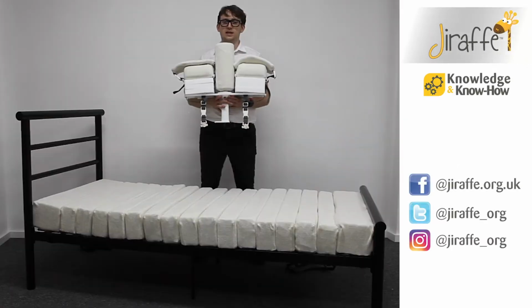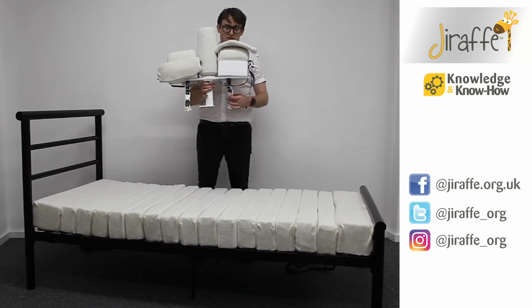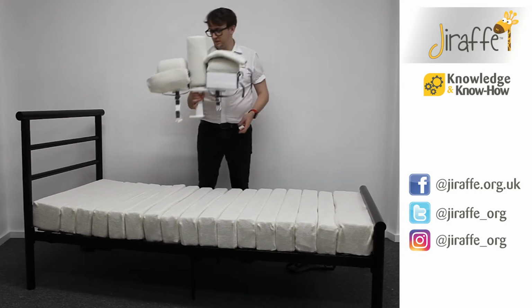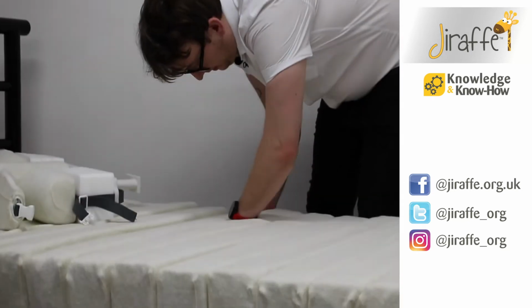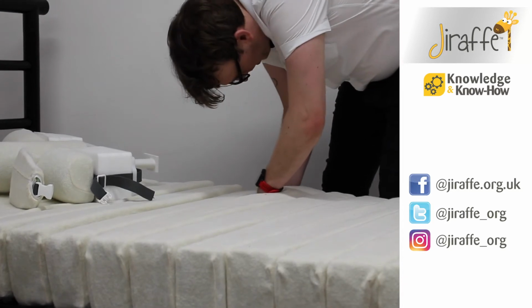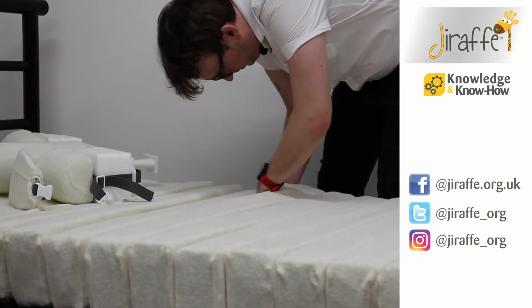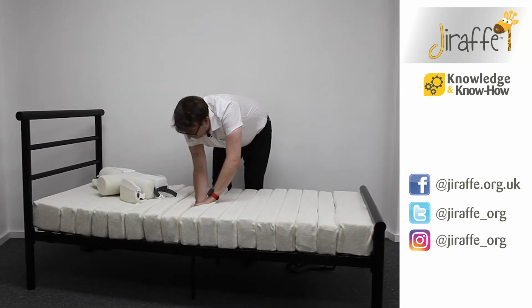We're going to take a look now at the Jenx Dreama T-roll. So to fit the locking feet first, we just need to unclip, and then we can feed that into place. So this is going in between the mattress logs and in that alleyway.